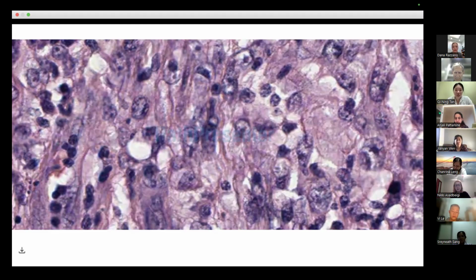The other thing is what they say: basically, if you go on a high power 40x and you see more than 10 cells which are positive for PRAME, you can consider it as a positive marker. But if you're having scattered cells, especially in the head and neck area or the hands of elderly patients that have a lot of solar elastosis and sun damage, you can have background PRAME positivity in those cases. Again, for melanocytic lesions, when you're between severe and melanoma, I think it's going to be a very good marker, but it's not a 100% marker.